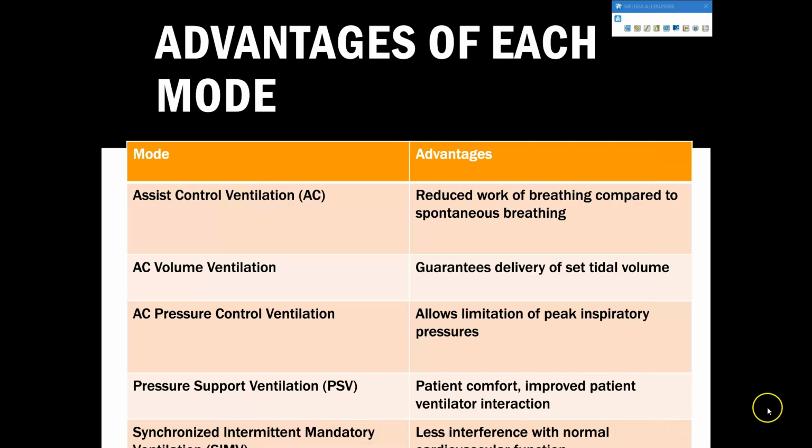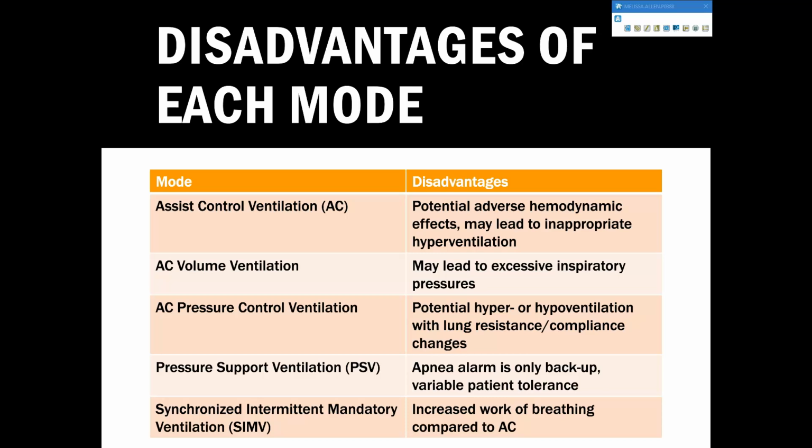And then SIMV is always better because it does interfere less with cardiac function. That's kind of why your cardiac surgeons like it. And also, on that odd patient that you don't want to not be able to come off the vent, it's going to allow them to wean more quickly, okay? So we've all seen a patient tank hemodynamically the second we put them on assist control. It changes the hemodynamics and the cardiac system immediately.